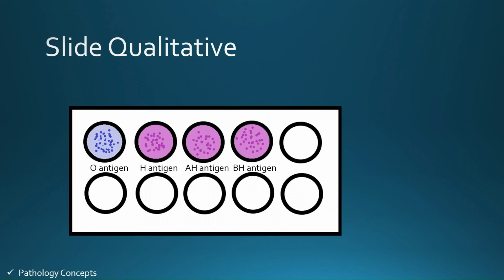If agglutination is present, then the test is positive. So if our qualitative test comes positive, then we can go for quantitative test. In the quantitative test, we have to do the serial dilution and we have to extract the exact number of the dilution where the agglutination is positive.